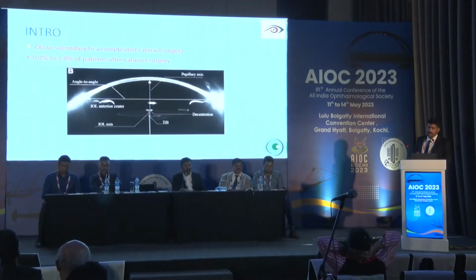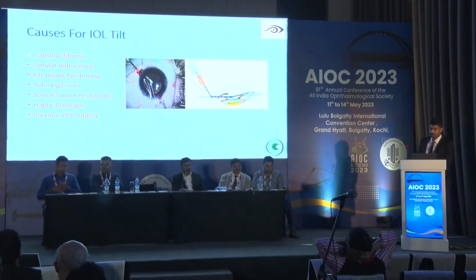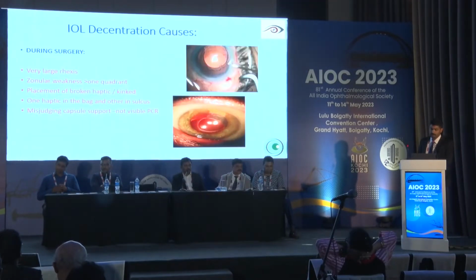So up to 0.2 to 1.8% of patients after cataract surgery can have IOL tilt. With the present advancement in instrumentation and techniques, I'm sure it's more towards the 0.2% than the 1.8%. But still, there are cases where we encounter decentrations and tilts.